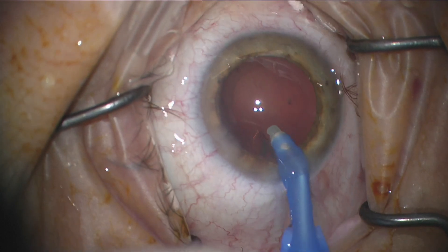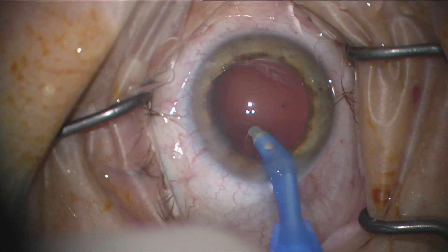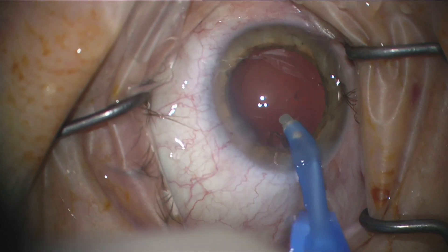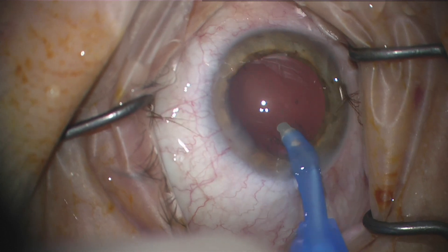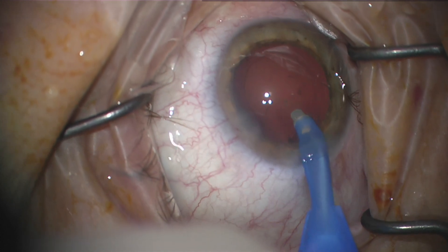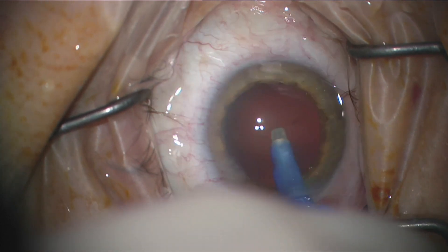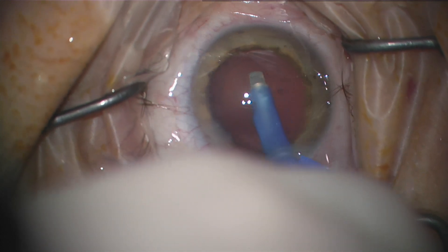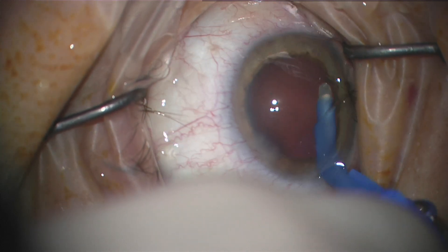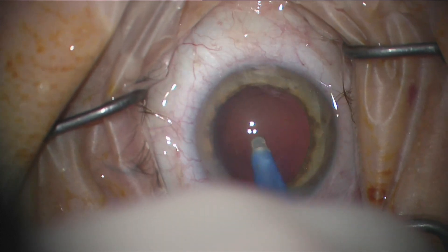I'll be honest — I have cut the anterior capsule once, maybe even twice, when aspirating and pushing down on the throttle, because it does chew it up a little bit in irrigation aspiration mode. I'm still learning that process and I don't quite understand the cutting mechanism difference between the phaco part and the IA, because it still seems to cut and that seems risky. The polish setting I haven't quite figured out, so here I am mostly manually polishing the posterior capsule.